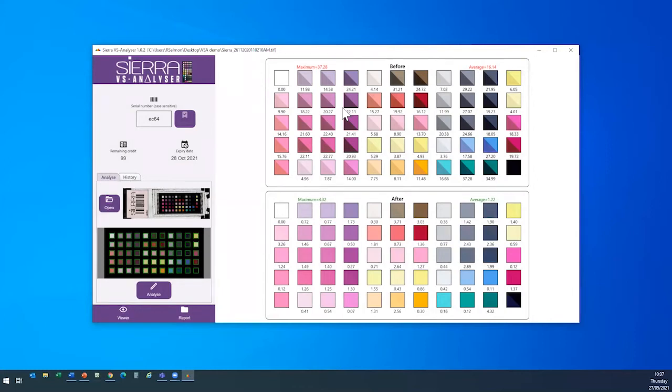And as we discussed before, delta E is a standard measurement that quantifies the color difference from absolute color truth, with the delta E level as close to 0 as possible being better. For human diagnostic purposes, we propose a threshold max delta E of 5 is widely considered more accurate than the average human vision capabilities when looking at tissue samples. And so here you can see we have also reported, for the purposes of quantitative validation, the mean and maximum delta E in both circumstances. And this is displayed on the top of each of the panels here.